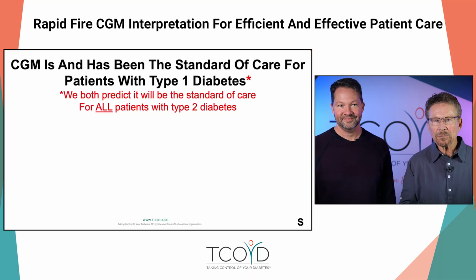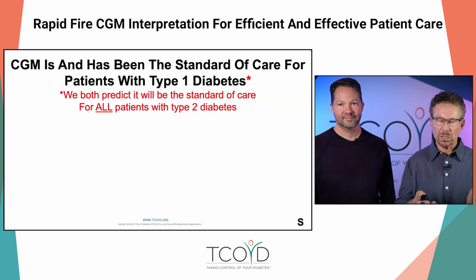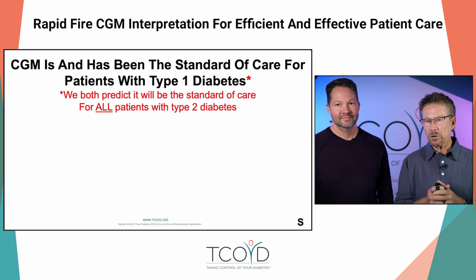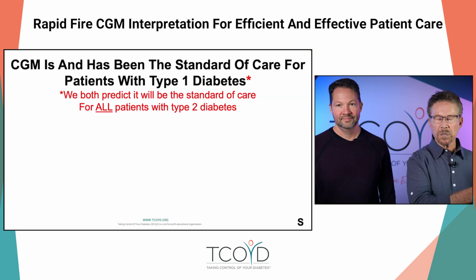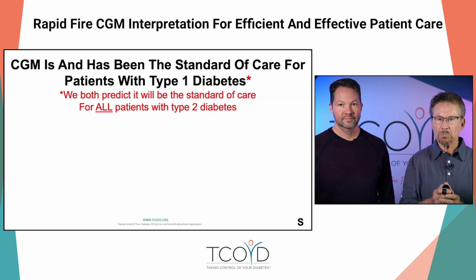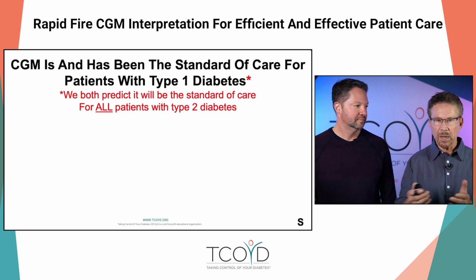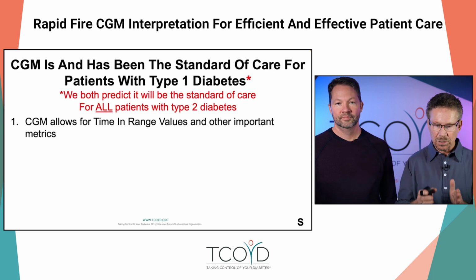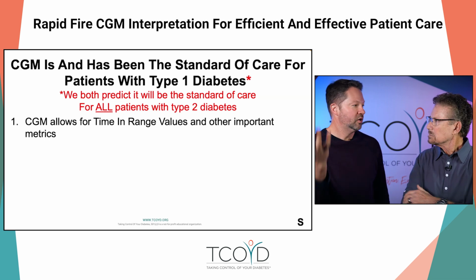All right. Well, CGM has been the standard of care for type 1 diabetes for a long time. Jeremy and I are pretty much ahead of our time. I don't mind saying that. And we believe that in the near future, CGM will be the standard of care for all patients with type 2, from pre-diabetes all the way up to insulin therapy. And we now know any type 2 on basal insulin or more than one injection a day is eligible by Medicare and many insurance companies because there are many values that go beyond just making adjustments in pumps and insulin doses.